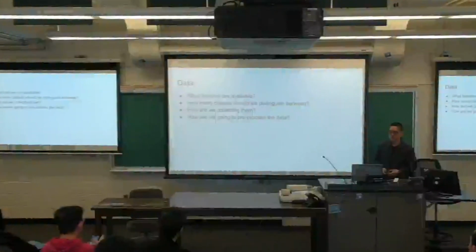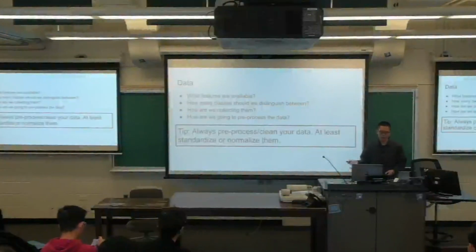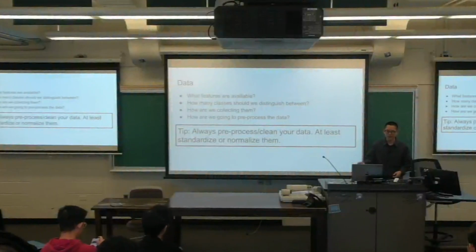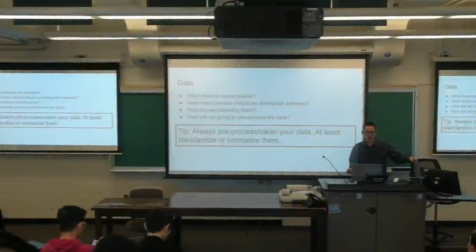Then the next question is, how are we going to pre-process the data? Then I want to give out the first tip I have. So throughout the lectures, I'm going to give out ideas that I think are important, which are going to be highlighted in this red rectangle. So always pre-process and clean your data set. So at least standardize or normalize them.